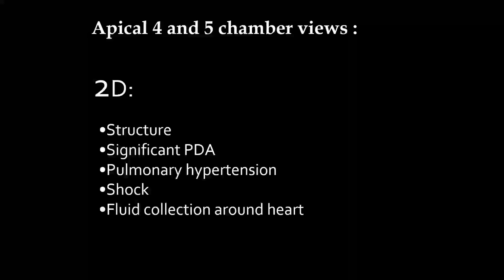So I'll start with the apical four chamber view. Then we have the sweeping movement. So now in the next few slides, first try to concentrate on this part of the slide. There you will see a video of how to keep the probe on the baby's chest.